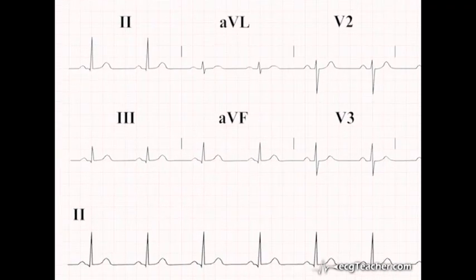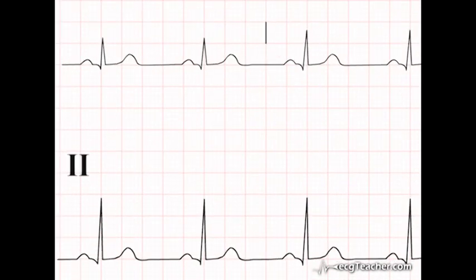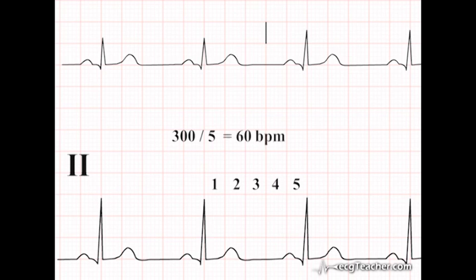Look at the rhythm strip on this ECG. There is 1 R wave present to every 5 large squares. So, in 300 large squares there will be 60 R waves present. This patient's heart rate is therefore 60 BPM.